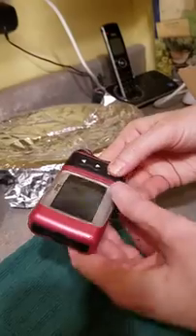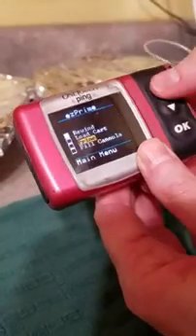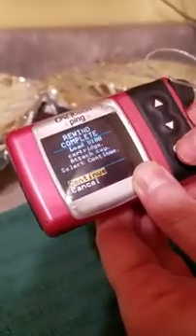Twist the cap back on. I gotta wake up the pump. Gotta go back to that menu, the prime rewind menu. And I'm gonna hit OK on load cartridge. And I'm gonna hit continue, and it's gonna show us. And we're going to shoot insulin out of this. Yeah, we'll prime it, but right now it's gonna load and tell us how much insulin we put in there.